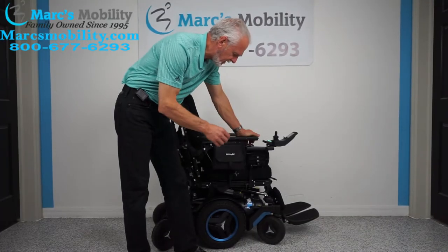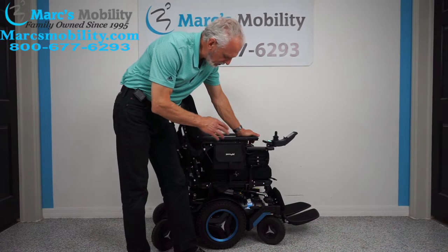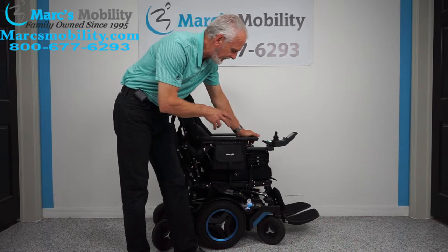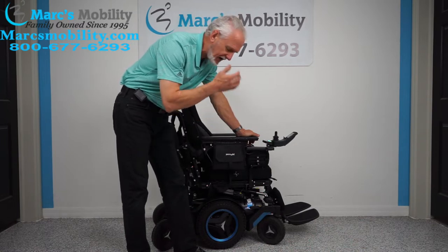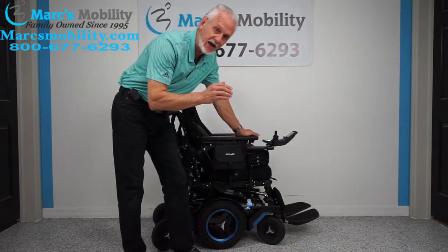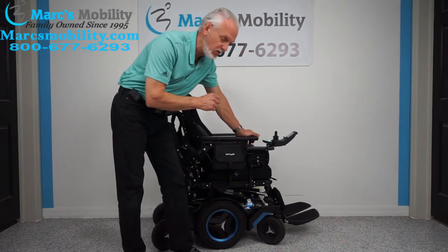Hello folks, we have here what's called a Permobil M5, blue in color. The M5 is almost impossible to find — you're not going to see any out there. The M5 is the top of the line in mid-wheel drive with Permobil. This chair will go up to 7 miles an hour, so it has the high speed motors.